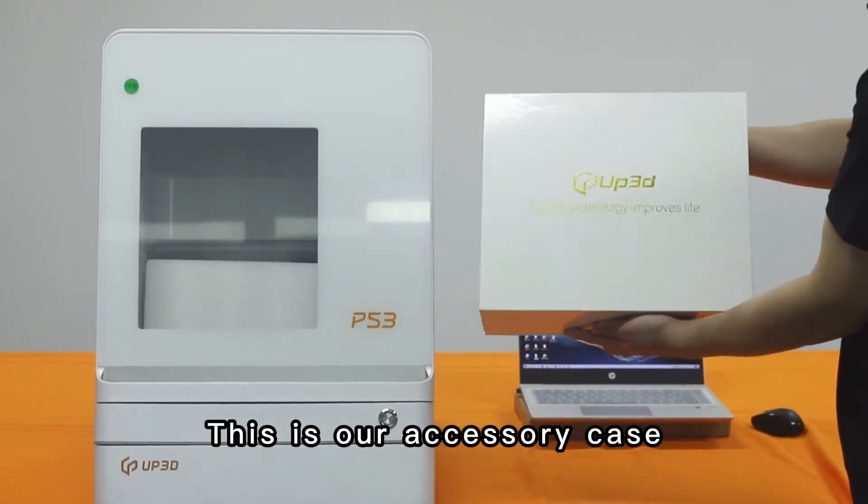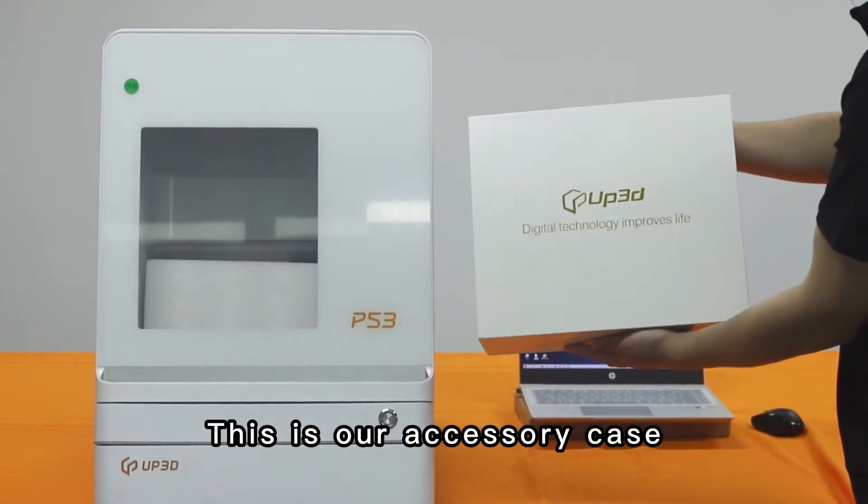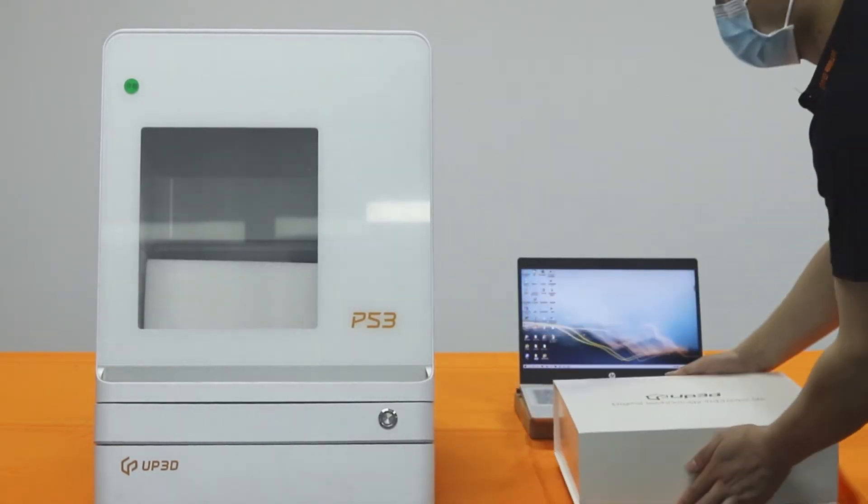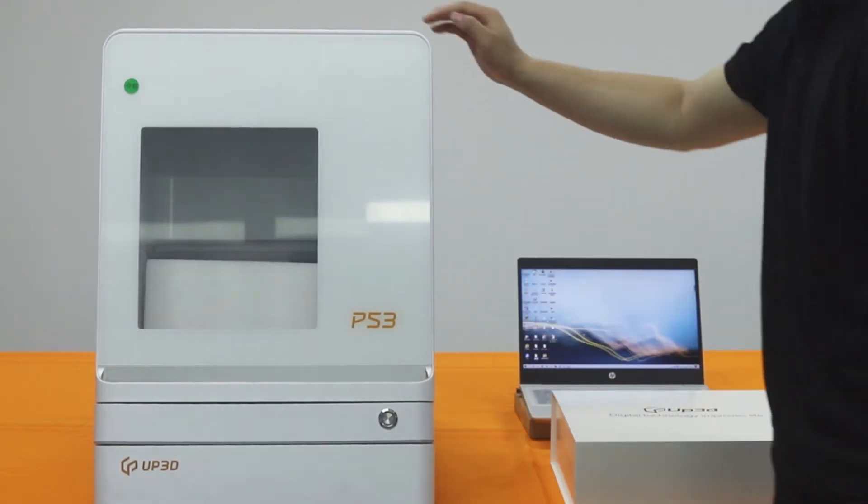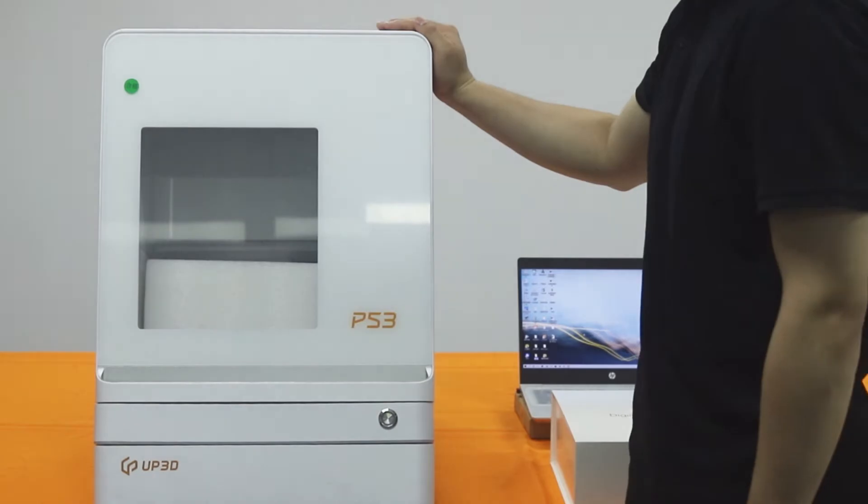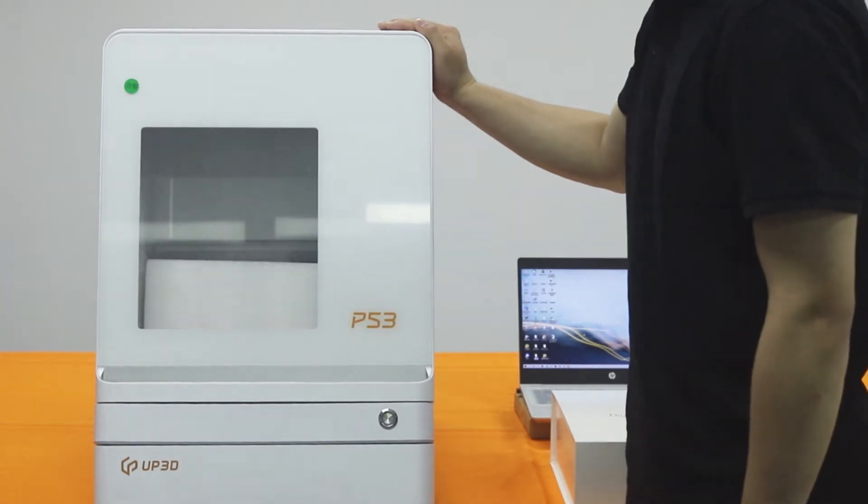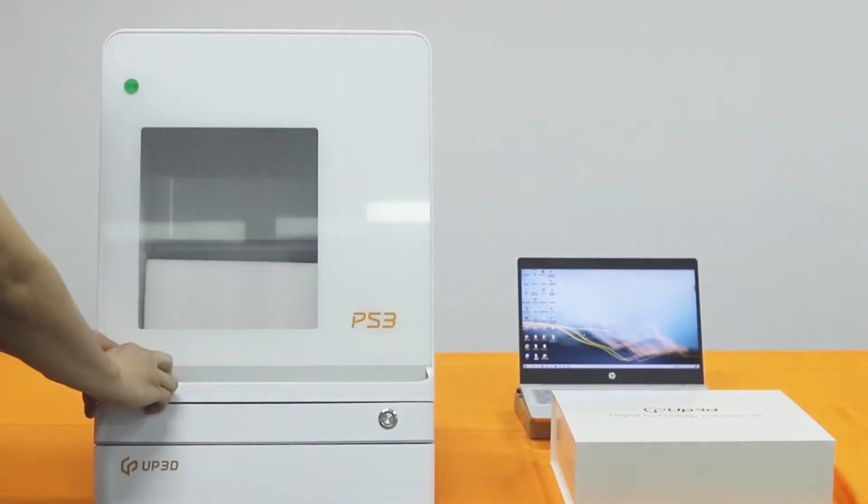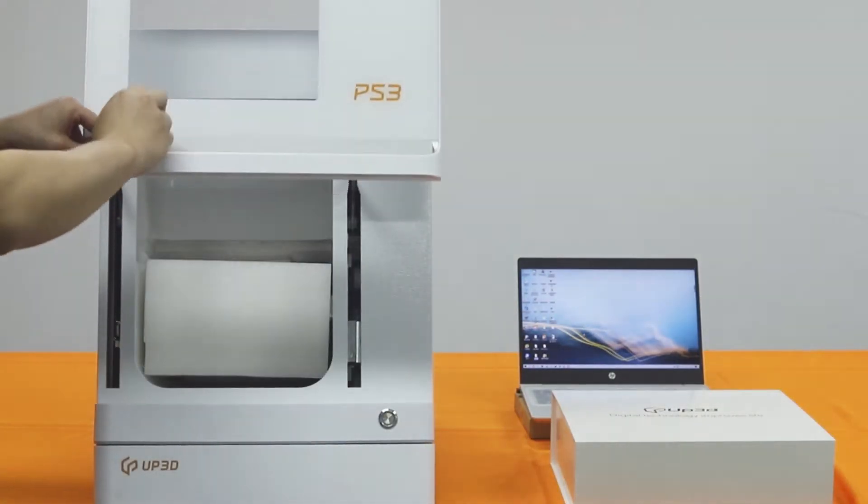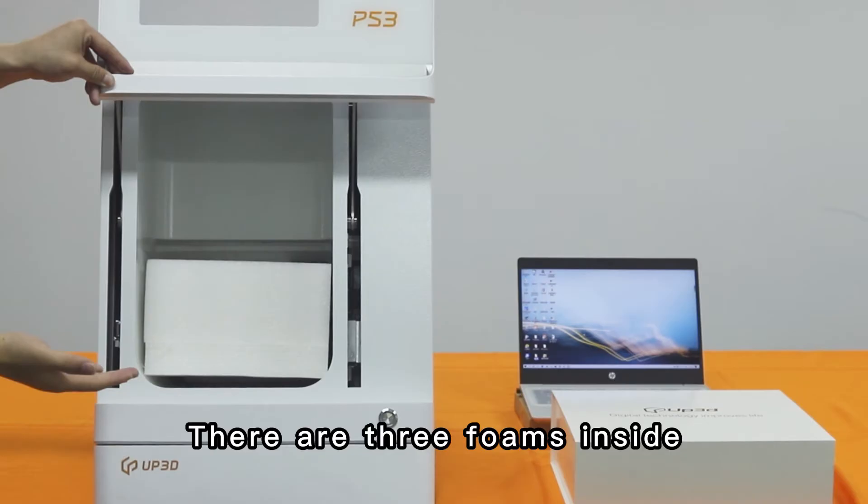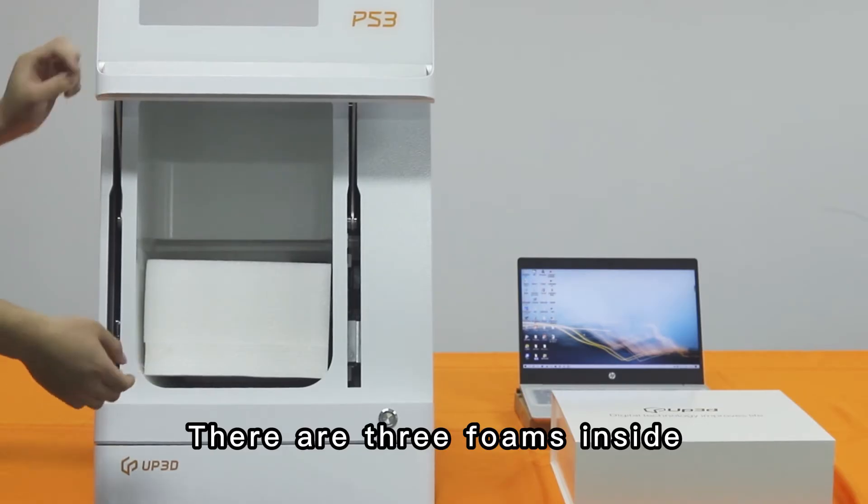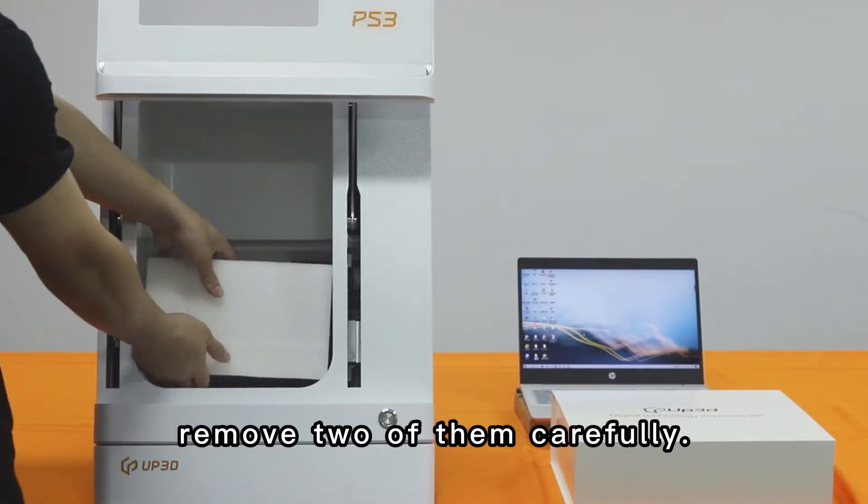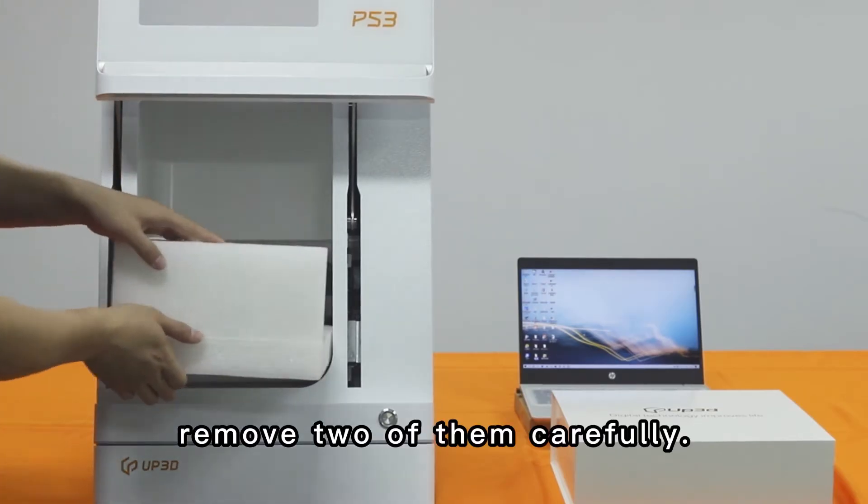This is our accessory case. Open the door. There are three foams inside. Remove two of them carefully.